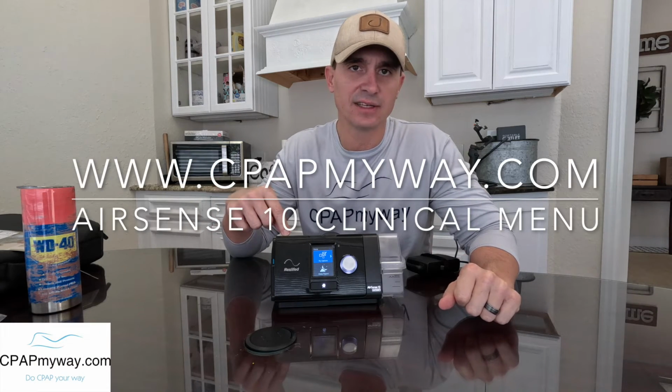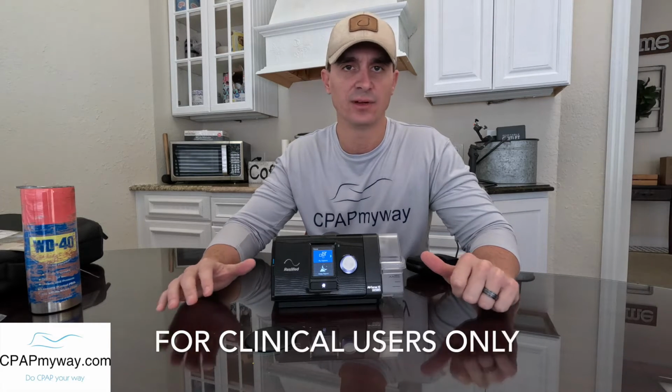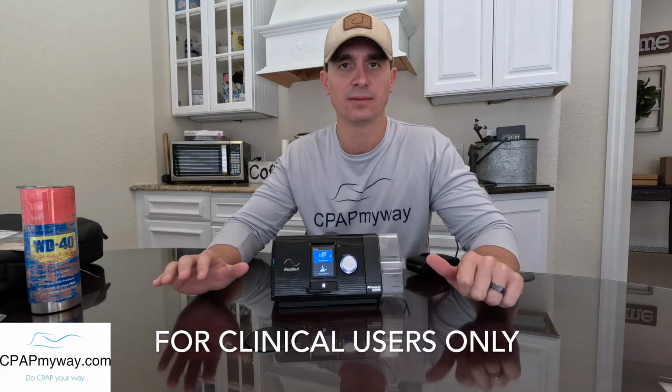Today I'm here to discuss the AirSense 10 and the clinical adjustments and settings. So this is going to be the clinical menu where providers or your clinician go in and make setting adjustments. If you're doing it under the supervision of a doctor, make sure you check in about all this kind of stuff, and don't get in here if you don't know what you're doing or have no idea what settings CPAPs control.